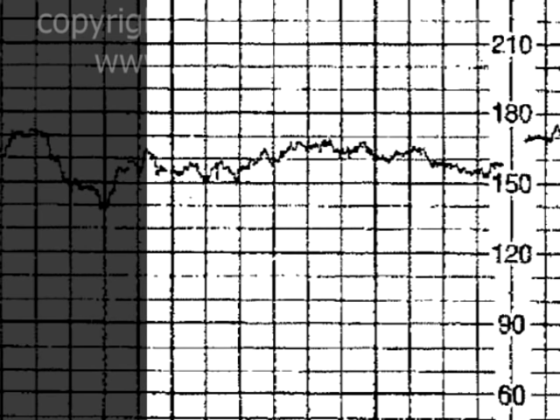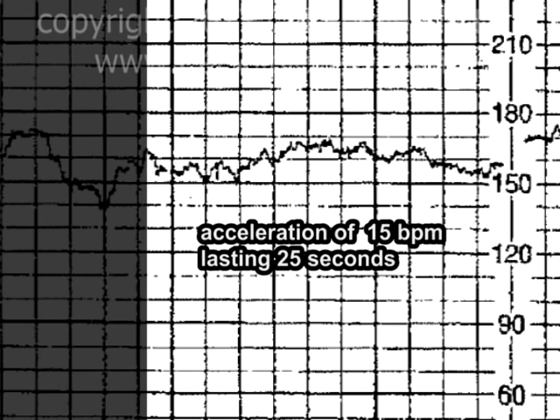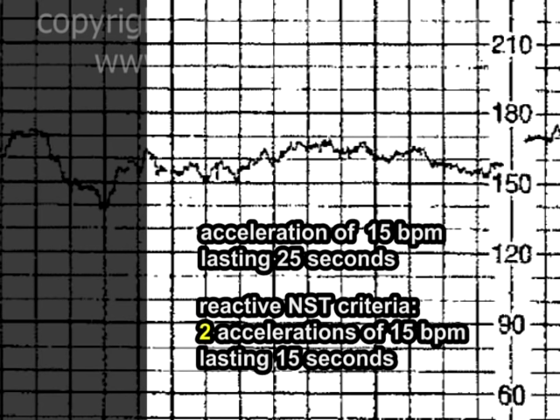Turning now to the duration of the acceleration, and again we'll be somewhat conservative on this estimate to be on the safe side — we see a duration of about 2.5 lines, equivalent to 25 seconds. So in summary, we have an acceleration of 15 beats per minute lasting a duration of about 25 seconds. This acceleration does fit the definition of an acceleration seen in a reactive NST: an acceleration of at least 15 beats per minute with a duration of at least 15 seconds.